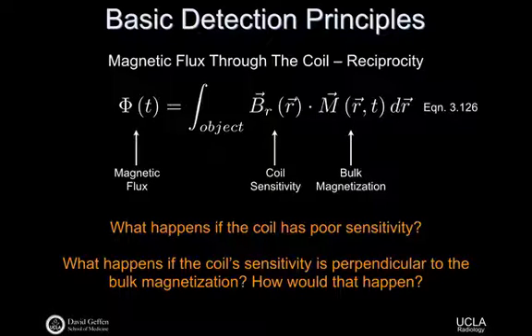So we have small coil elements. We can put a small coil element on your shoulder, we can put it on your chest or something like that. If I put it on the top of your head, for example, though, I'd get very little signal from that. It simply has the wrong orientation. So the dot product there is important.